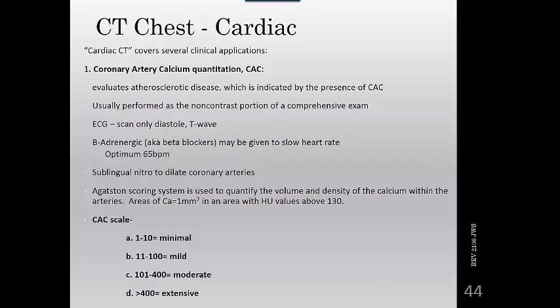Cardiac CT is ECG gated. That means that the patient is connected to an ECG machine that feeds information to the scanner. And as the heart rhythm is monitored, the scanner is only going to scan when the heart's in diastole, and that's the resting state of the heart. And there's significantly less motion during that time.